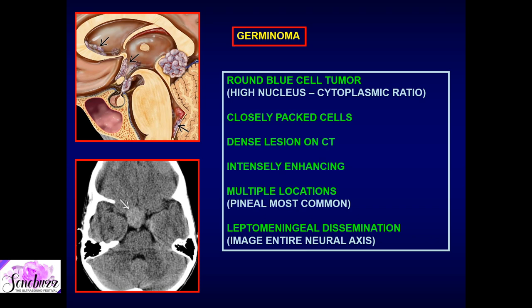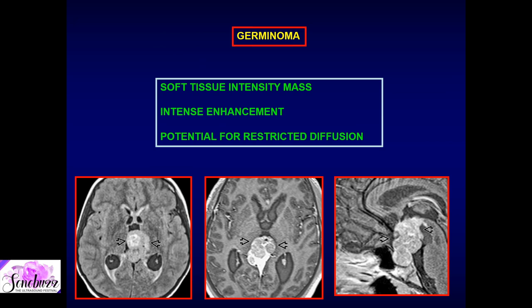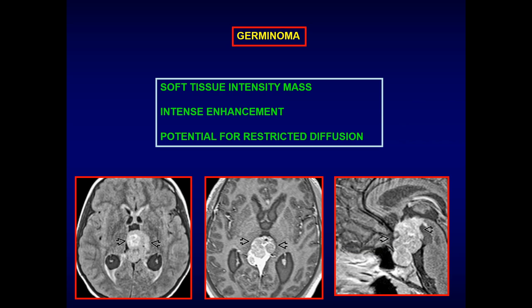On non-contrast CT, it is a hyperdense lobulated mass — this one sitting in the suprasellar or inferior third ventricular region. On MRI, it is an intensely enhancing mass. Two separate tumor examples are shown: one in the suprasellar third ventricular area, another in the pineal gland region. This is a lobulated soft tissue neoplasm in the CSF region, and like choroid plexus carcinoma and medulloblastoma, we must image the entire neural axis.